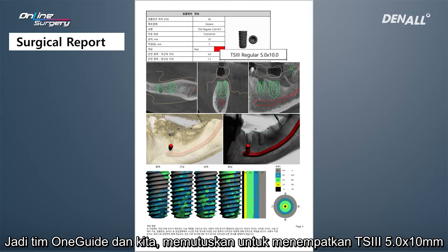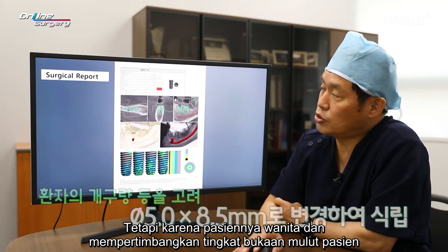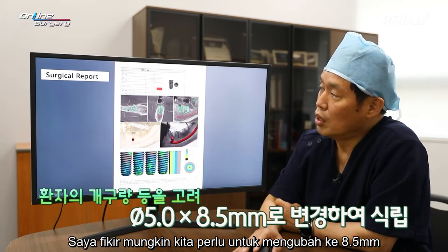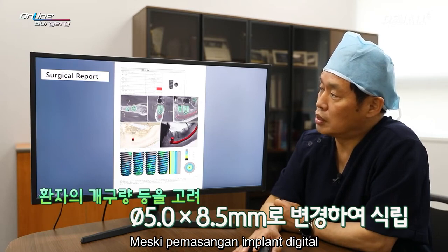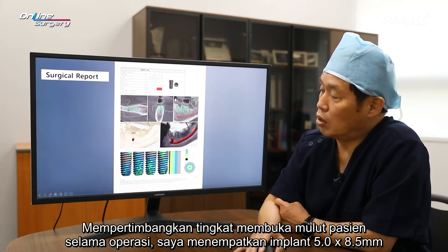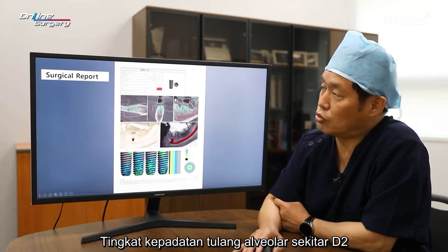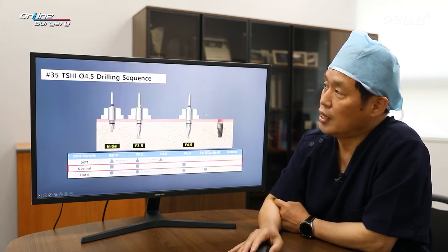So the OneGuide team and we decided to place a TS3 5.0 by 10 millimeter implant, but the patient was female, and considering the amount of mouth opening, I thought maybe we need to change to 8.5, even for the distal implant. Considering the patient's level of mouth opening during surgery, I placed a 5.0 by 8.5 implant. The bone density itself is approximately D2.